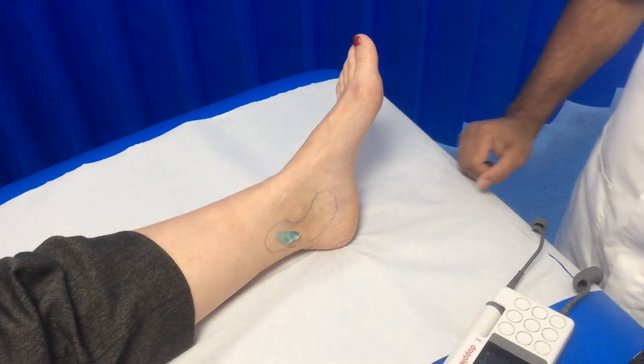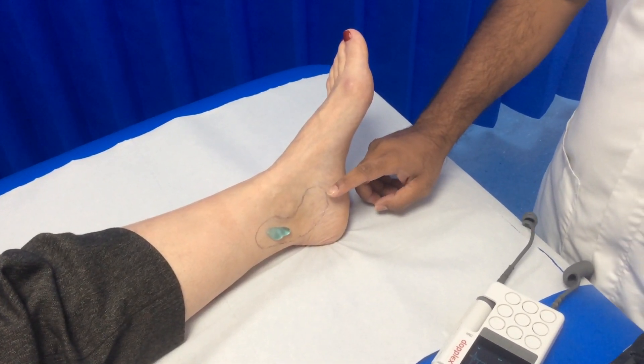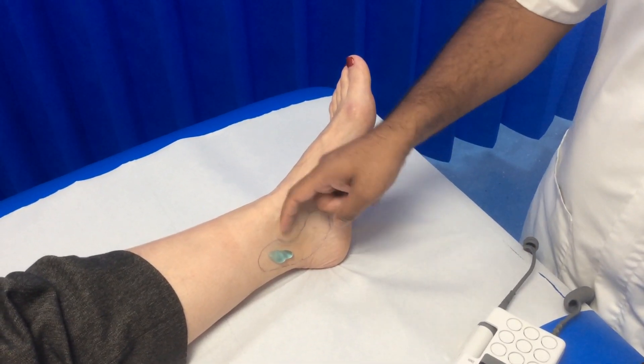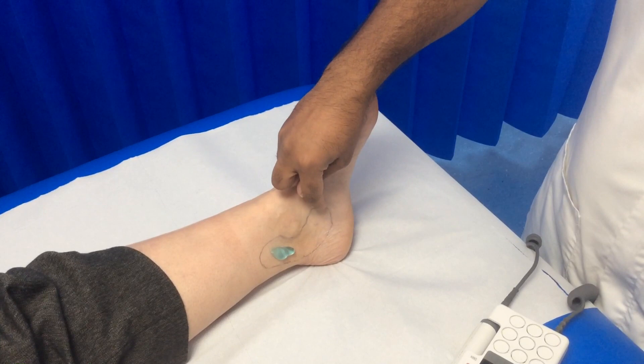Today I'm going to demonstrate how to check for the posterior tibial pulse using the Doppler. I'll be looking for the pulse behind the medial malleolus in this area.